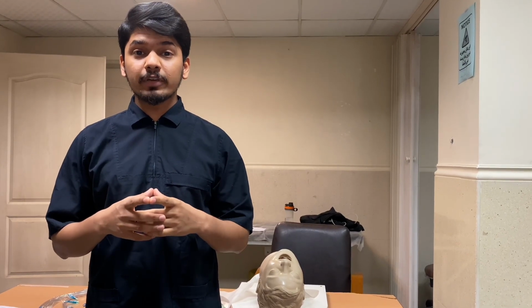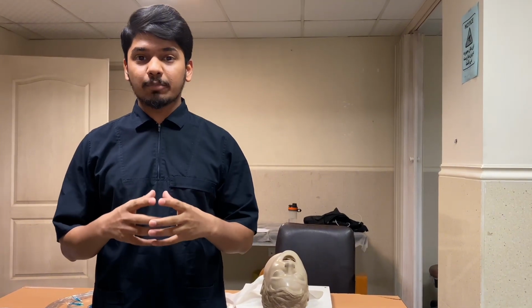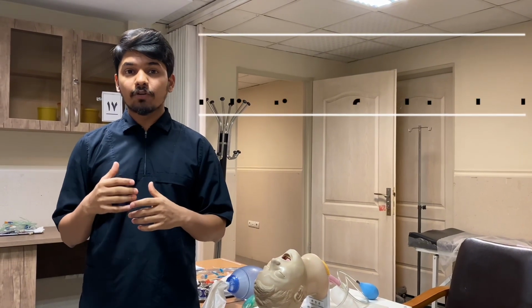Endotracheal intubation is a process in which we fix an endotracheal tube inside the patient's trachea to make him breathe passively. In this video, I will take you through a step-by-step process of endotracheal intubation. There can be several reasons for intubating a patient.